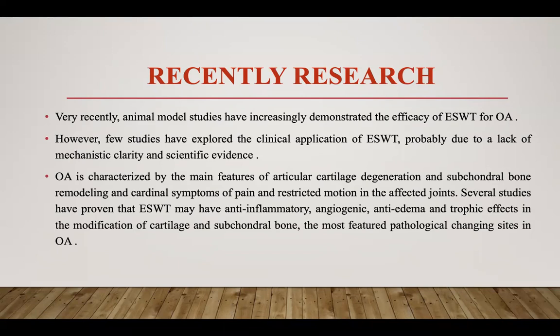Several studies have proven that extracorporeal shockwave therapy may have anti-inflammatory, angiogenic, anti-edema, and trophic effects in the modification of cartilage and subchondral bone, the most featured pathological change site in osteoarthritis. There are many recent researches, but a few of them are here.